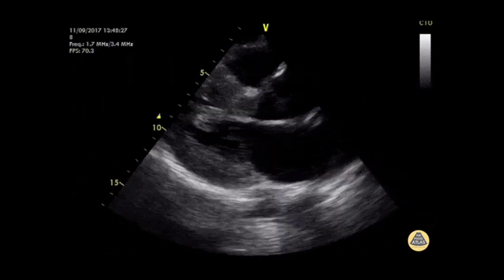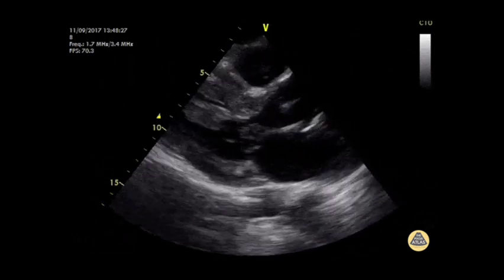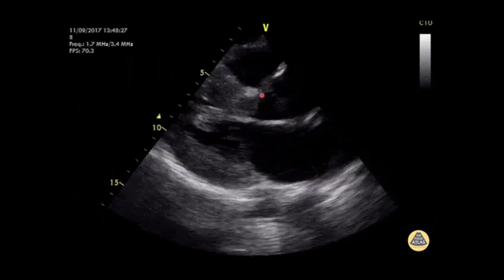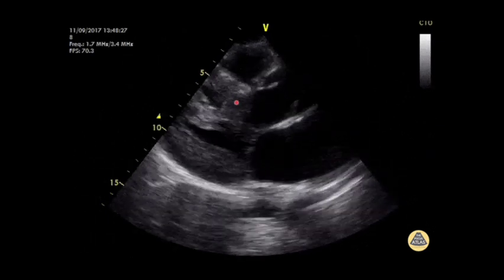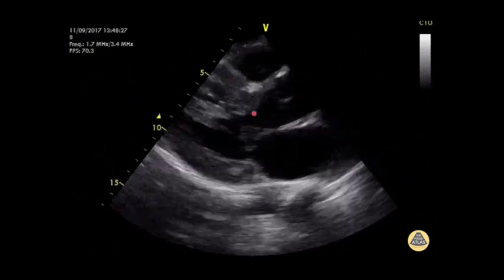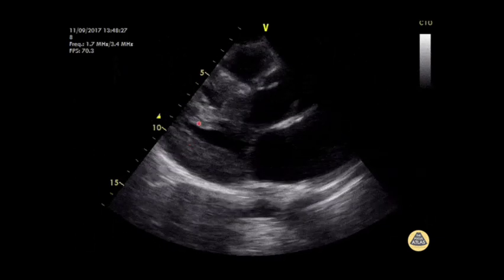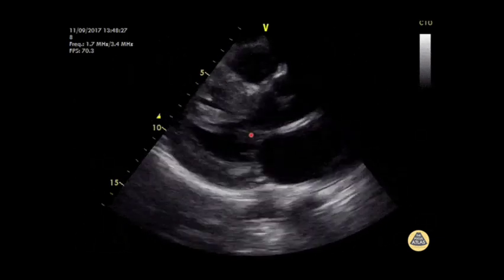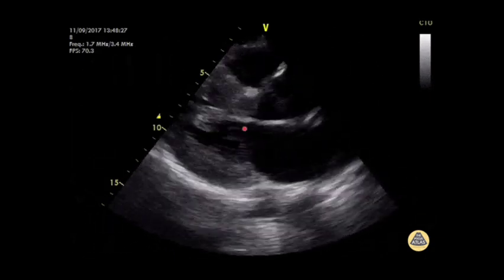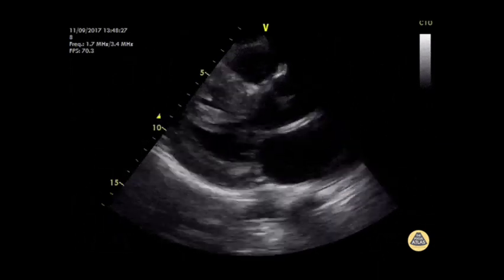So here we see a parasternal long axis view of the heart, and we see that mitral valve leaflet. Typically, as it goes up and slaps the intraventricular septum, it has to traverse a pretty far distance. But here we can see that there's actually thickening of this intraventricular septum in this pattern right next to the aortic outflow tract, which is pathognomonic for hypertrophic obstructive cardiomyopathy. And indeed, as this ventricle contracts, you can see that there is a close approximation due to systolic anterior motion of the anterior leaflet of the mitral valve that could, in the right patient, obstruct the outflow of that ventricle.